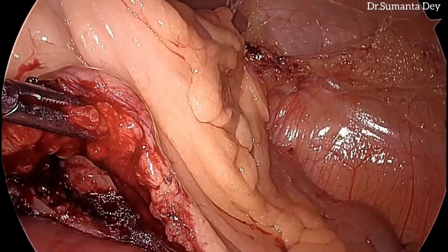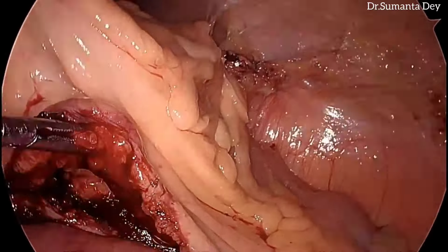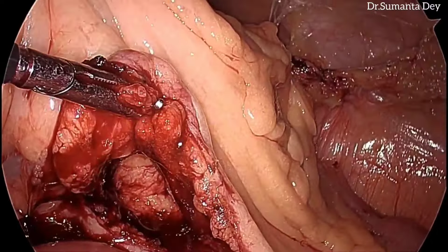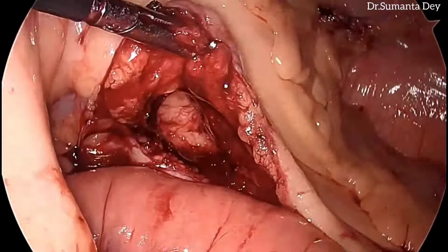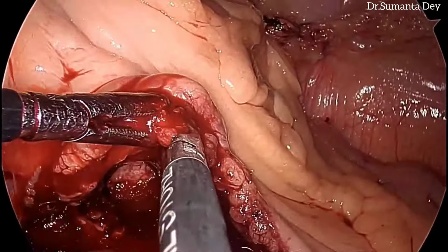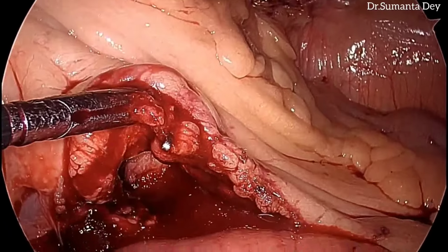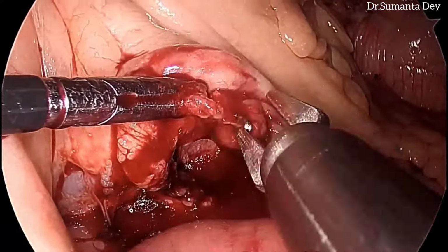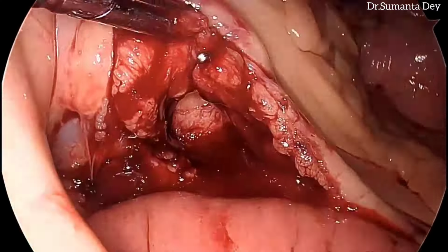During the process of dissection near the IMV, there was a branch of the artery of Moskowitz, and there was bleeding, a small spurter, so I clipped it. Initially one clip was applied, but there was bleeding, so I applied one more clip and the bleeding was controlled.